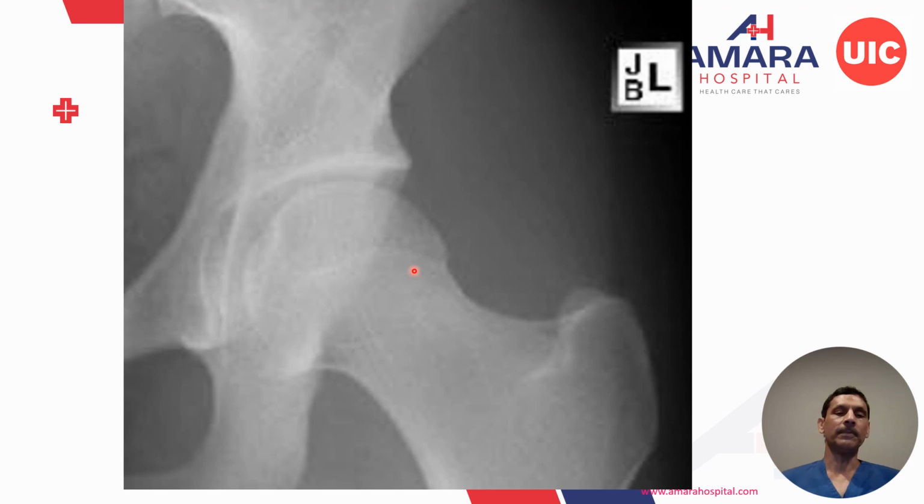Epiphyseal extension sign. The fovea is well located, not in the weight-bearing area. That's good. Otherwise a round, good head. Reasonable sourcil and joint space. Slight widening of the lateral joint space compared to the medial sourcil space. What this tells you is there probably was cam at a young age that remodeled this area and made this space wider. So as she flexes up, some of the sphericity is accommodated by this acetabular remodeling.